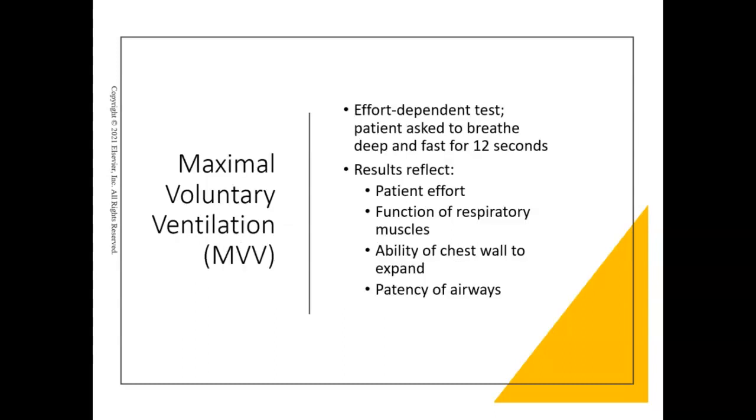All right, so now let's talk about MVV. Again, this is going to be an effort dependent test. During this test, the patient is asked to breathe as deeply and as rapidly as possible for at least 12 seconds. You tell the patient to breathe normally, and then to start breathing as deep and as fast as they can. They're going to go like that for about 12 seconds, which is how long the window is.